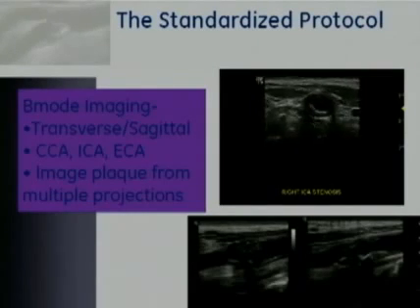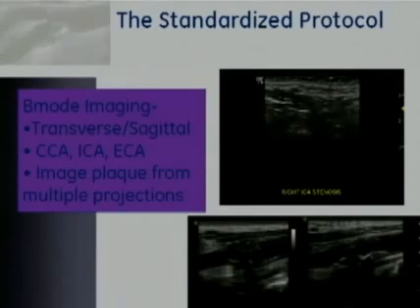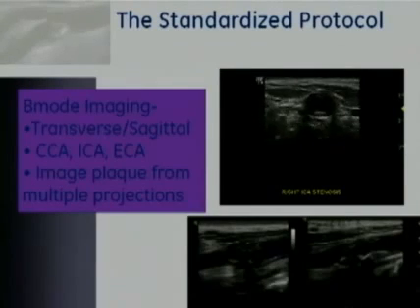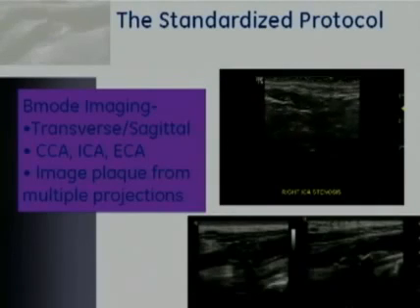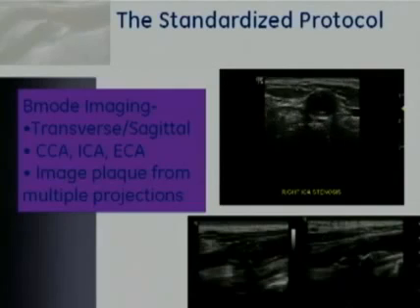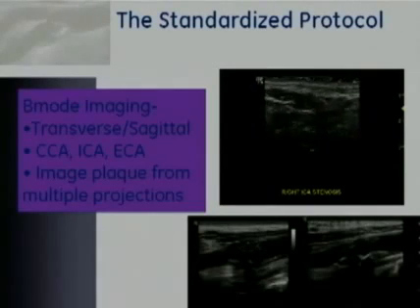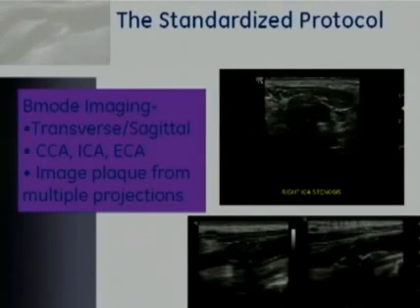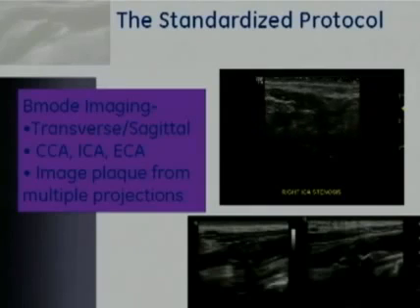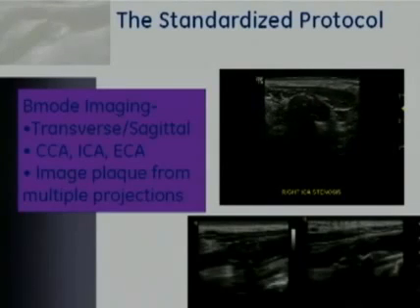That's very important that within each lab performing carotid Doppler that you have a protocol that is written down that can be followed by everyone in the laboratory. This will standardize the procedure and is very important for follow-up of patients. Because you want a patient who's coming back to have the exam done in the same way that it was done on the previous study, and that way it really makes sense for comparing from one time to another.